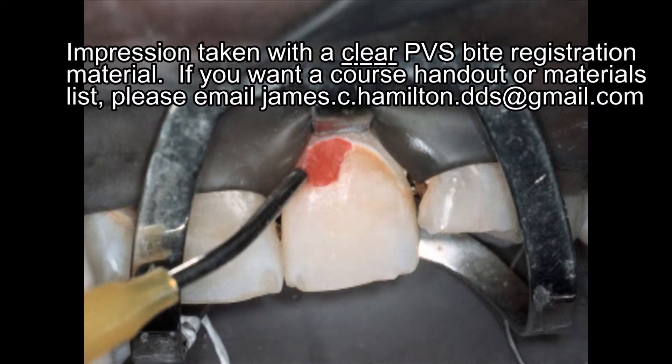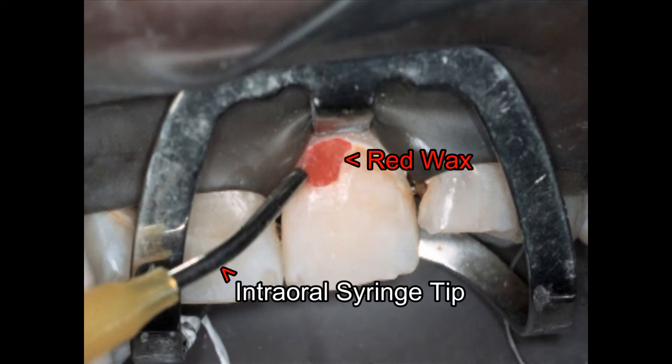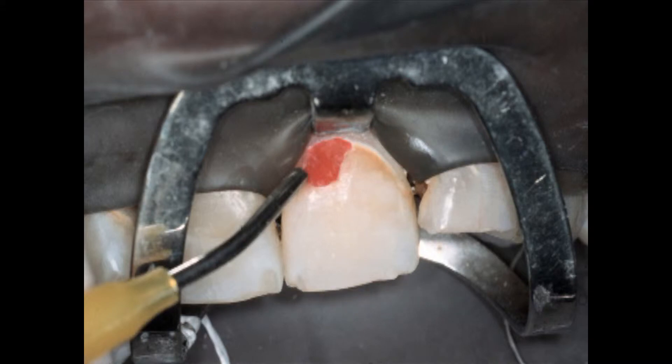Go ahead and take your impression. It's important here that this tip doesn't mar the surface of your red wax, otherwise that marring is going to show up in your composite and require you to do more finishing.